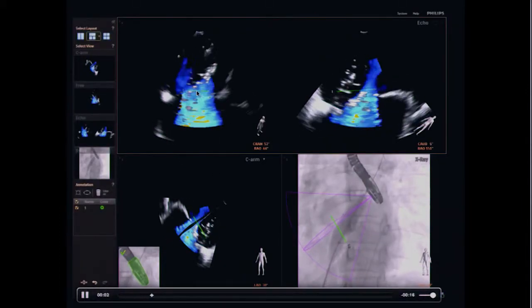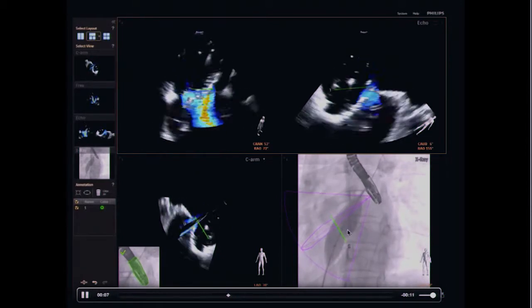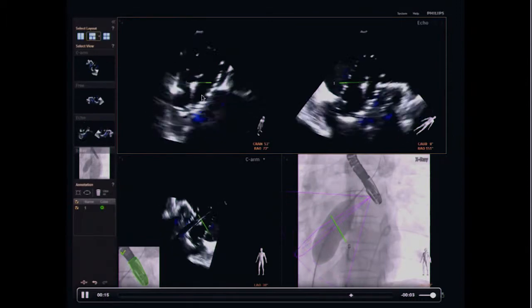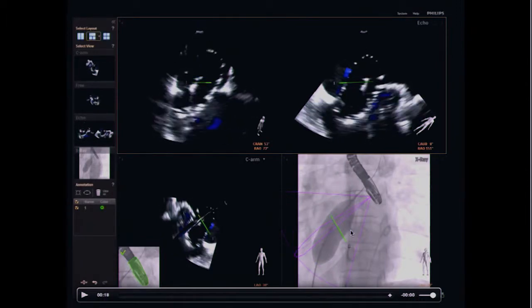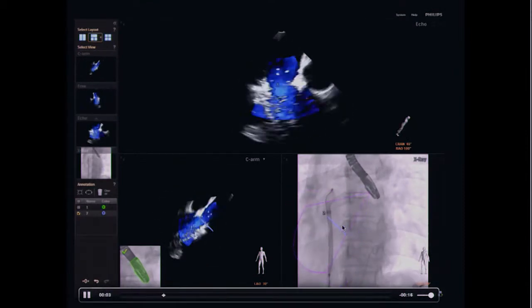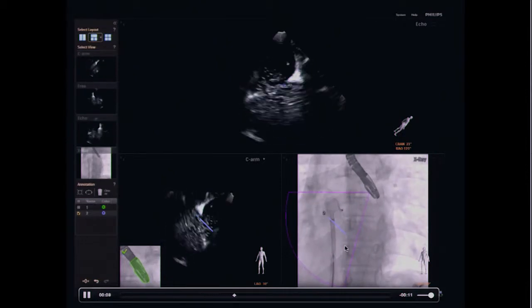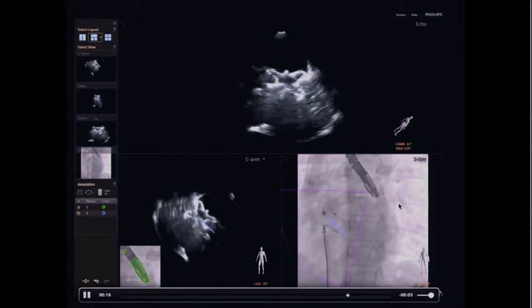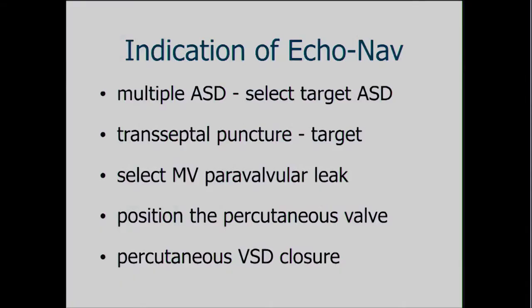This is an example: there is an ASD, and while I am performing a balloon sizing measurement, you can see a linear line on the echo just on the fluoroscopic image — it is well matched, and there is an indentation indicating the ASD. We can deploy the device while watching this ASD line, making it very easy to implant. For simple ASD closure, which is a very straightforward procedure, I do not use this, but for multiple ASDs where I first need to cross the bigger ASD, I use this imaging modality.